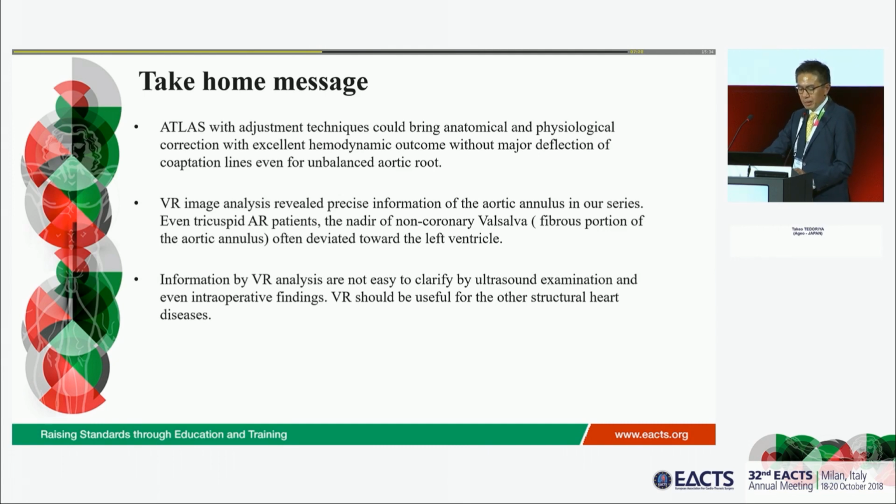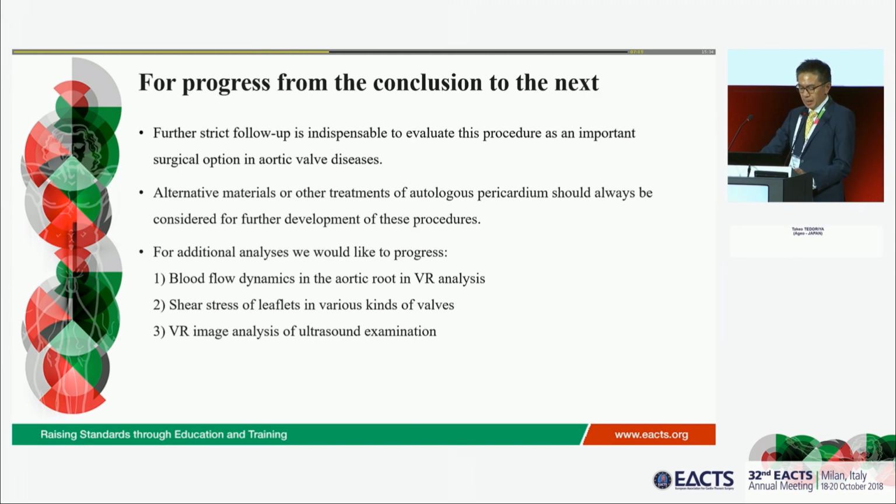Information by VR analysis is not easy to clarify by ultrasound examination, and also even in intraoperative findings. So further strict follow-up is indispensable to evaluate this procedure. It's very important. And also alternative materials or other treatments of autologous pericardium should always be considered for further development of this kind of procedure.